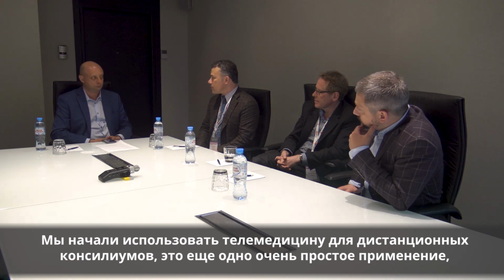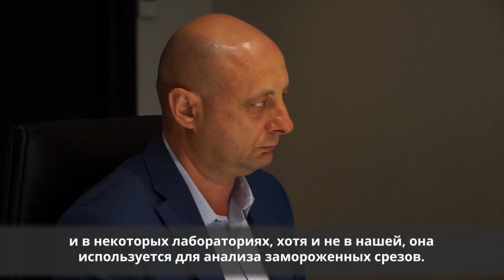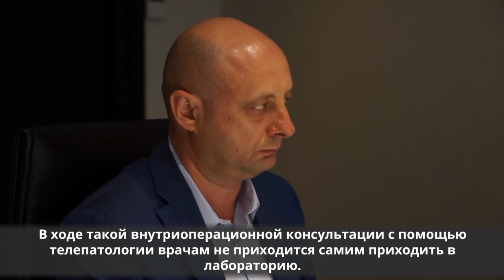That's another very straightforward application. And in some laboratories, although not in our own, it's being used for review of frozen sections. So intraoperative consultation through digital pathology, so that the pathologists do not have to come into the laboratory themselves. We can have assistants who are doing the sectioning and the scanning, and then the slides can be reviewed from afar, from offsite. So I see those as the main areas where it's really changing clinical practice and education of pathology.